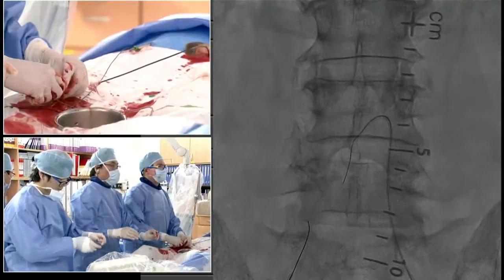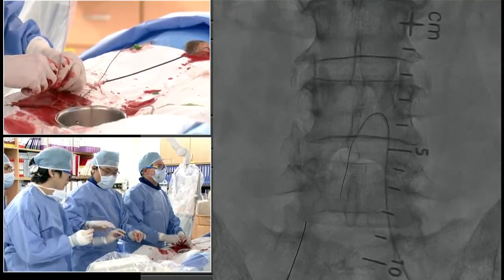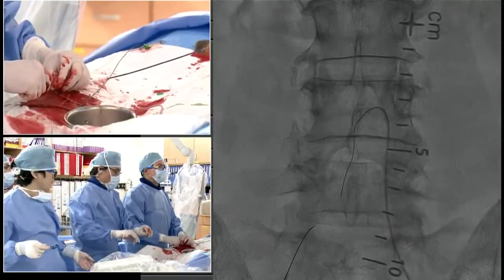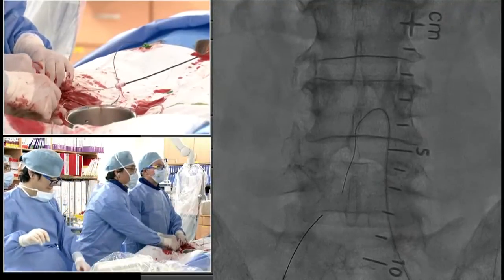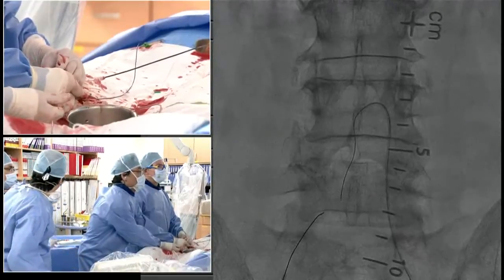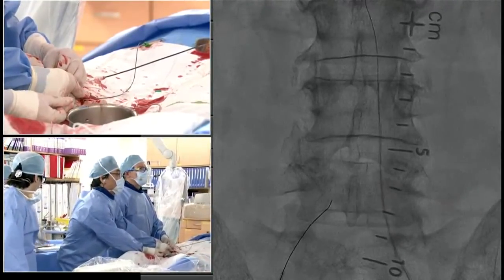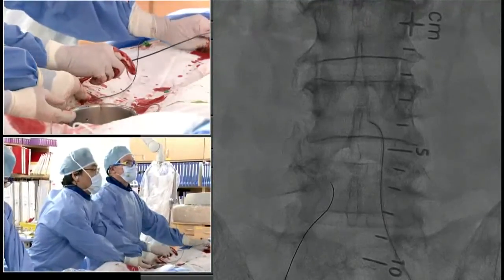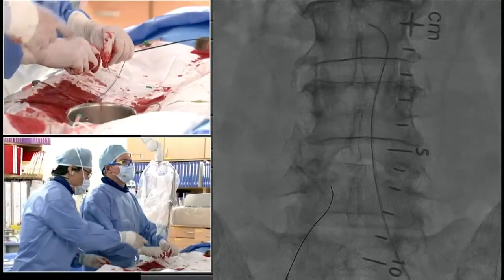Dr. John, which option would you prefer: both femoral approach, or right femoral and left radial or brachial approach? You know, my personal approach would be to use bilateral femoral access like was used here. But I think nowadays radial access is a very good approach to cross from above. You avoid the risk of complications with brachial access.